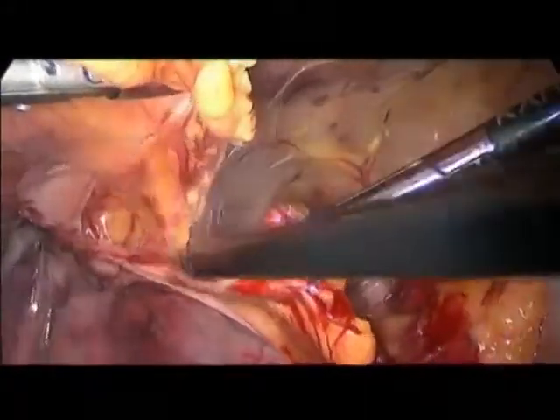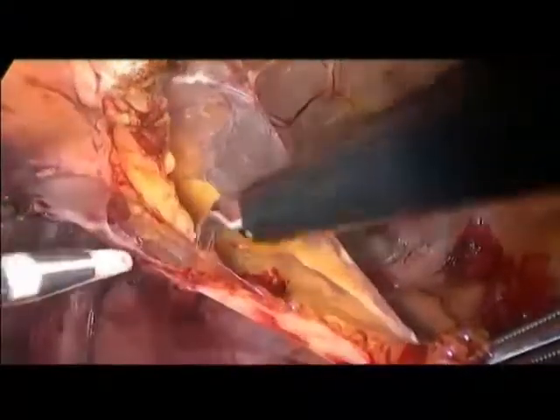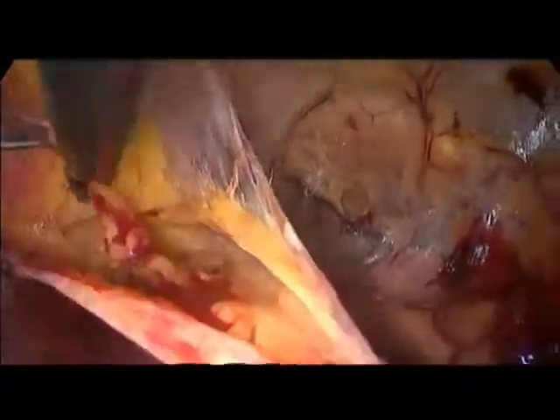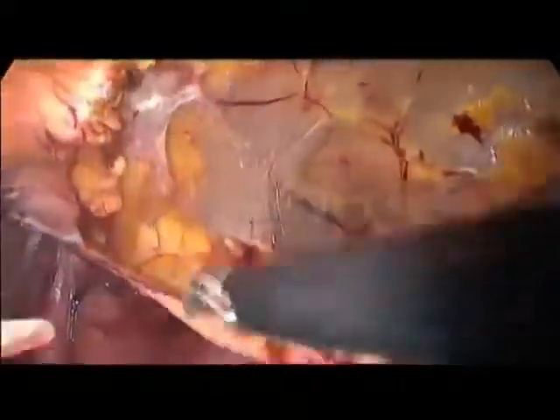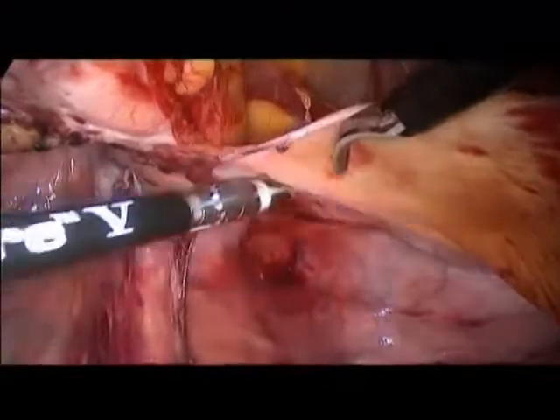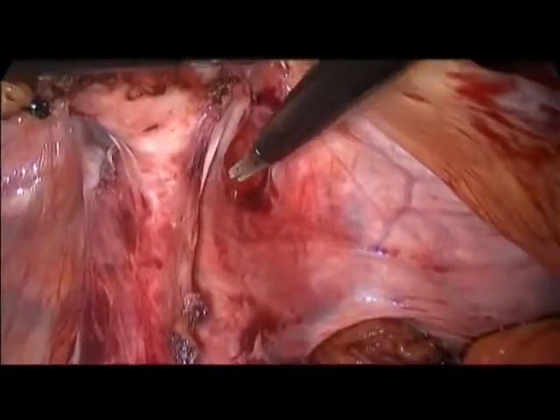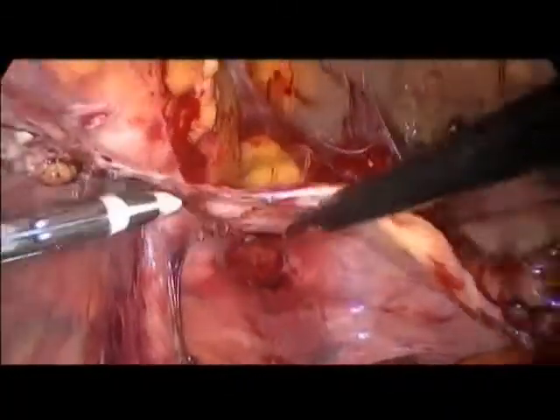You have seen we had a trap here with the epigastric pedicle coming very close, so that we had to remain medial to it, but otherwise this approach is quite safe. As I mentioned, if we had to perform lymph node dissection, and it's not the case in this patient because he's Gleason 6 strictly and PSA 4, so that we won't perform, but otherwise we would just extend this incision cranially along the vessels.